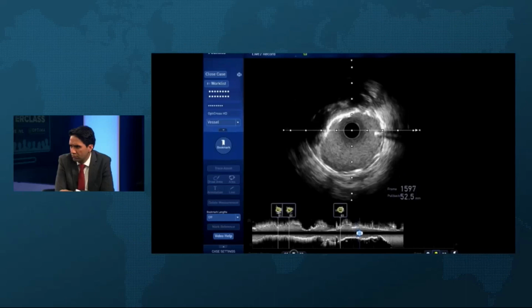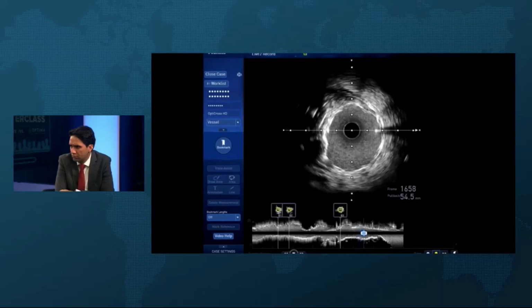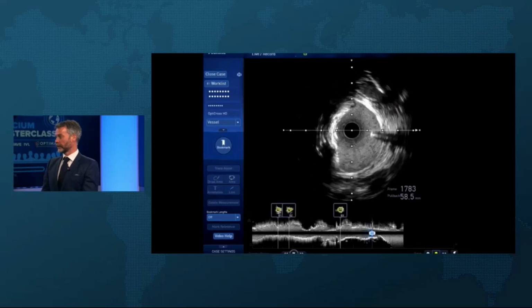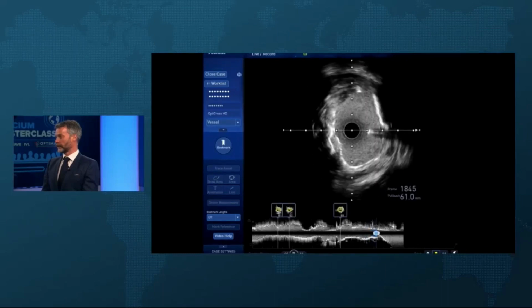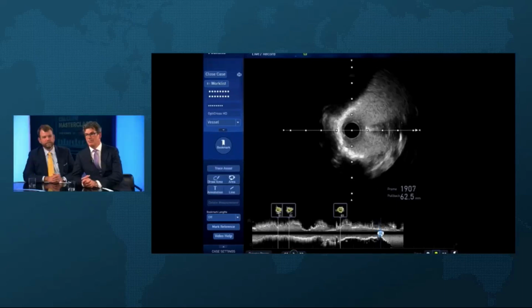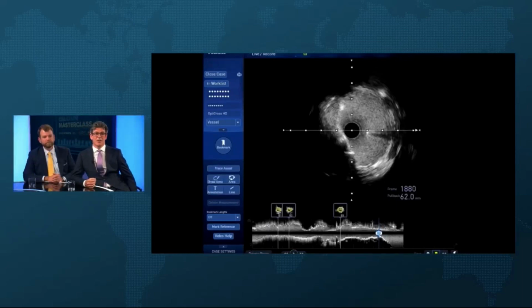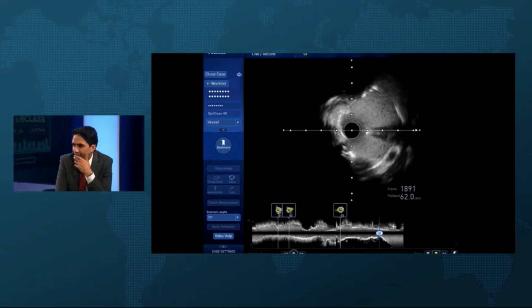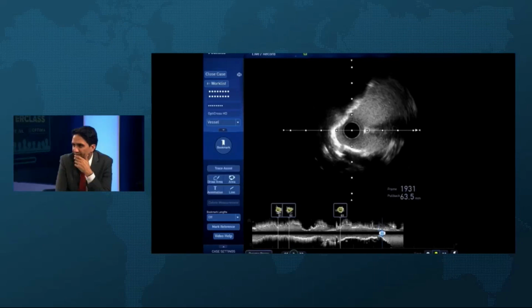It was underdone on the stent expansion, so we'll see what it is. You could see the nodule coming in then. That looks great. Still not bad though. It's just, again, going to be another D-shaped stent, but yeah, it looks good. Very good area. I think it's pretty good.